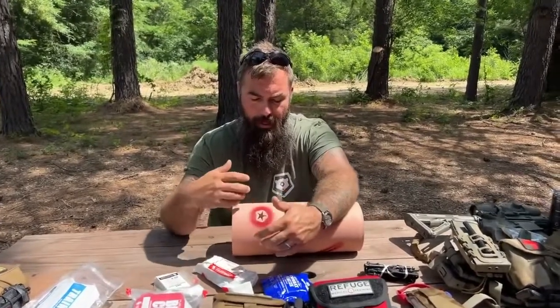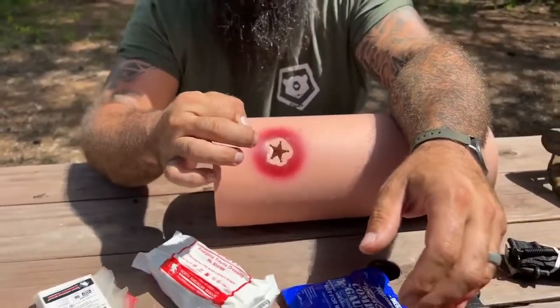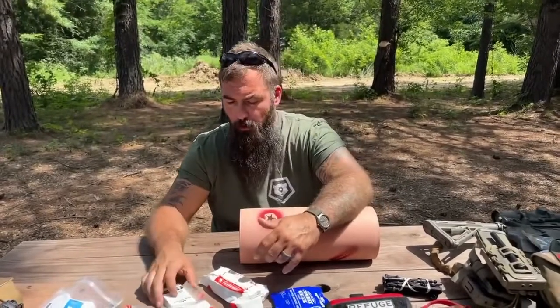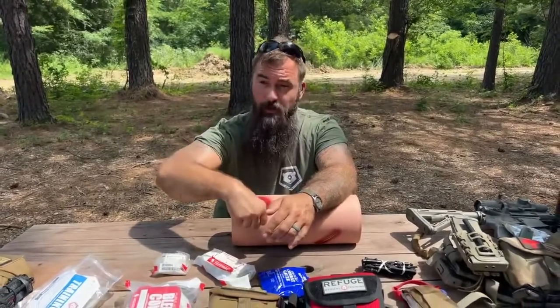The reason for that is in our simulated wound channel here — on what we call the 'baloney' that simulates a leg — here's our gunshot wound right here. When the gauze goes in here, just like we use a tourniquet to compress the bleeding vessel by applying pressure and constricting the vessel, when we pack the gauze in, we're using the pressure of the gauze to pinch off the bleeding vessel as well. If you use all 12 feet of this gauze to fill this wound, when it's pulled out by a medical professional, only the last six to twelve inches will have blood on it if you packed it properly. The rest fills up the void of the wound channel to apply pressure to the bleeding vessel, so it pinches it off.